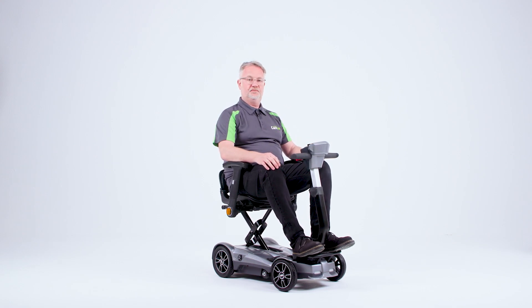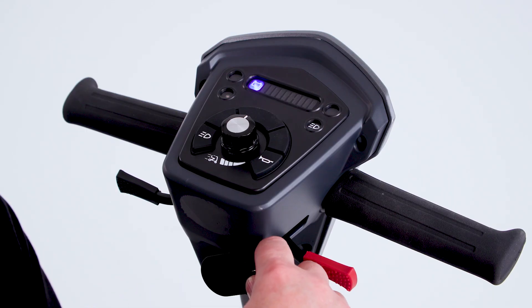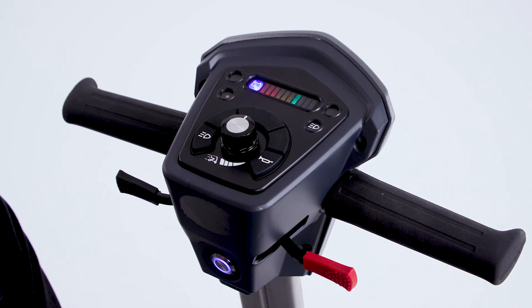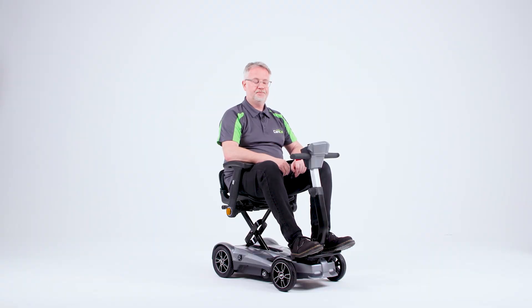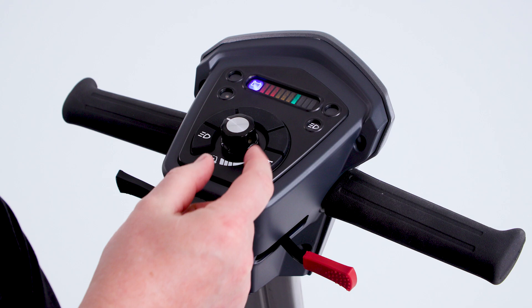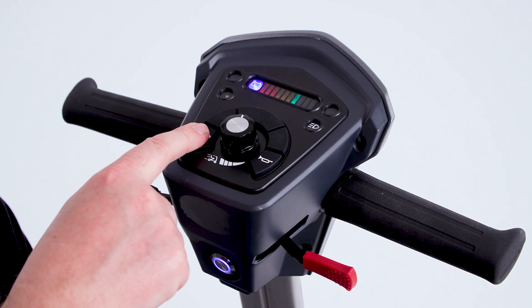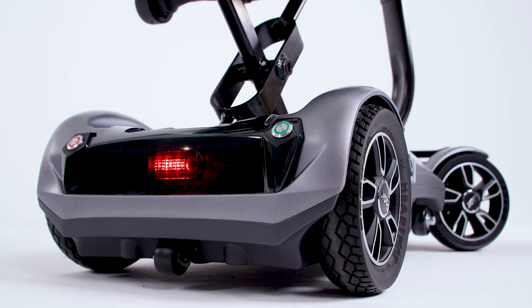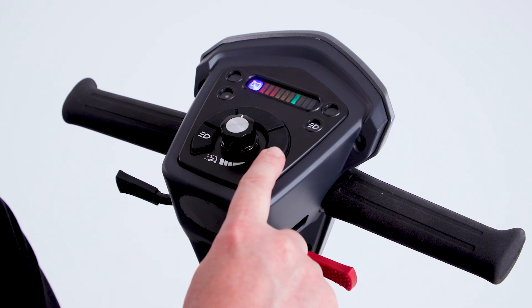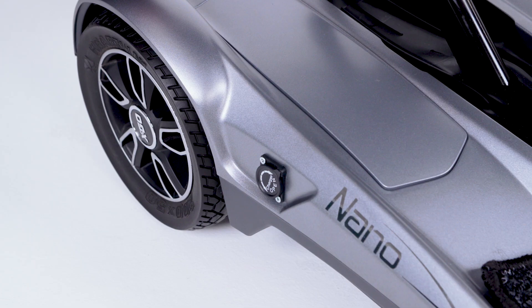To operate the scooter, we press the button at the bottom of the tiller. With our key fob, we place that against the button and that button turns blue, and the dials illuminate to show us how much battery is remaining. On the controls, we have the traditional wigwag throttle lever and the control of our maximum speed with this dial. The maximum speed is four miles an hour, but we can reduce this for when we're in a shopping centre. We also have a light button which illuminates the light on the front and also the rear of the Nano, and we have a horn button. The charging point for this scooter is situated on the side, and that's where we would charge it. When you receive the scooter, we'd advise that you charge that for up to eight hours or until the charging light turns green.